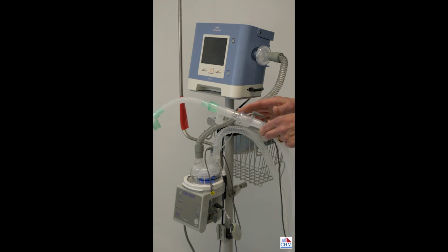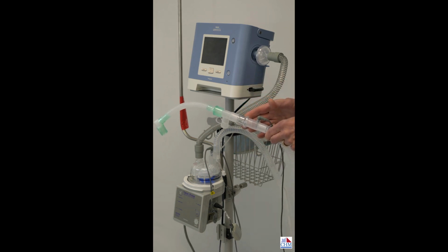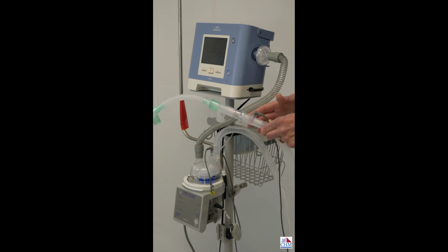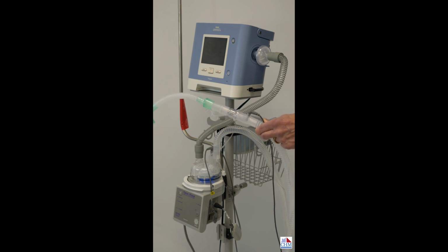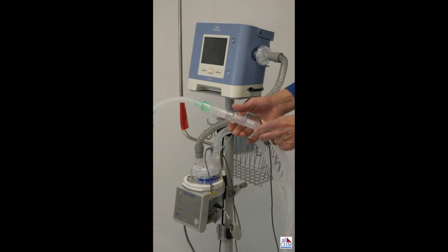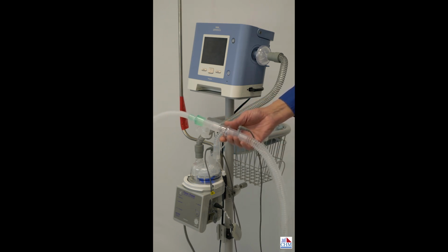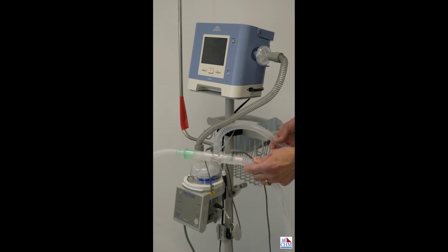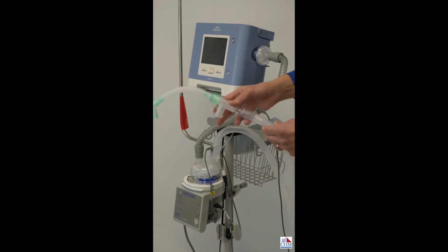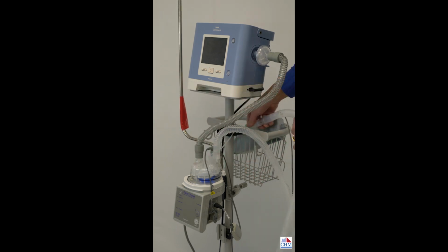This is the same concept. If you know of anybody that uses a CPAP machine or a BiPAP, it's the same concept with that mask. Those masks have holes in them, and it provides a similar leak so that the CPAP or BiPAP patient is not rebreathing CO2. So that's what a passive circuit is. I just wanted to make it clear that we're looking today at the passive circuit for the Trilogy. So let's go over the different components so you know what we have here.